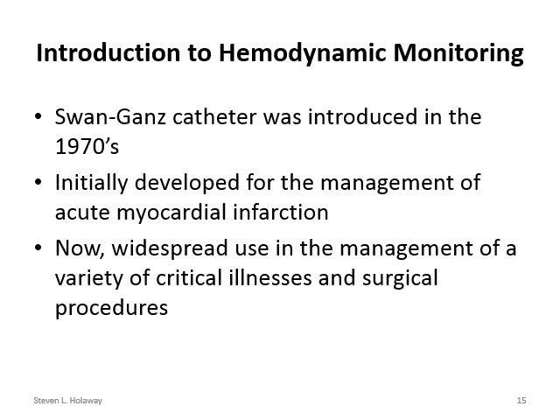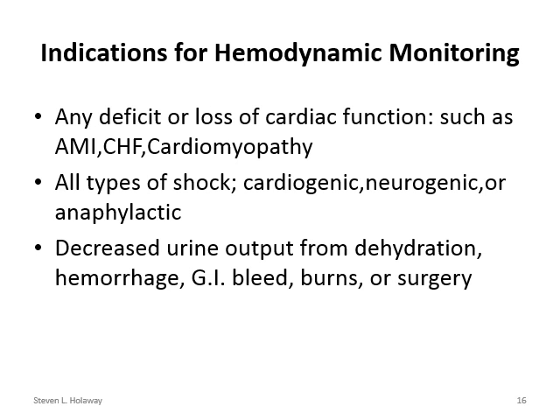Now, almost any patient that has an MI will not have a Swan-Ganz. So most places that you're going to see a Swan-Ganz or a pulmonary artery catheter is in post-heart surgery, maybe someplace like a medical ICU or a surgical trauma ICU where we're having to manage multiple pressor agents on those patients, or in severe burn patients where we're having, again, to manage fluid shifts. And so those can help us manage those types of patients. Now, just like everything else, there's good and bad that goes on with these systems.